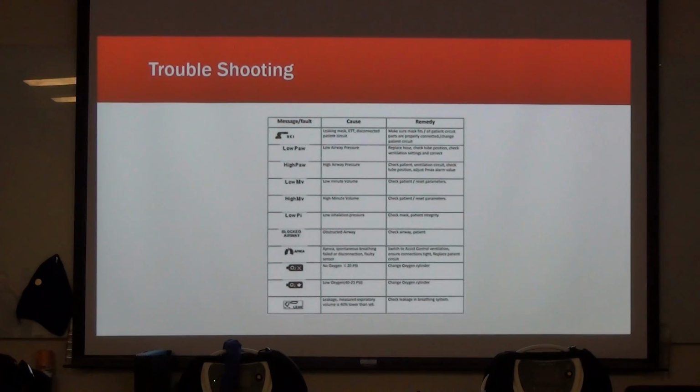On the old one, yeah, because it's restrictive. It's not giving you the full value. Well, that, and it wouldn't even work, man. The apnea alarm, everything went off when I tried to hook up. Three different times I tried to hook that ventilator up. Well, think, everything you're gauged at is at 55 to 60, and you're functioning 10 pounds of pressure less than that. So you're already behind the 8-ball, and everything's screwing up because it's pretty sensitive. Look at the CPAP we have right now. You're like, give me that throwaway piece of garbage and get this high dollar thing out of my face. It's driving me nuts. Right.